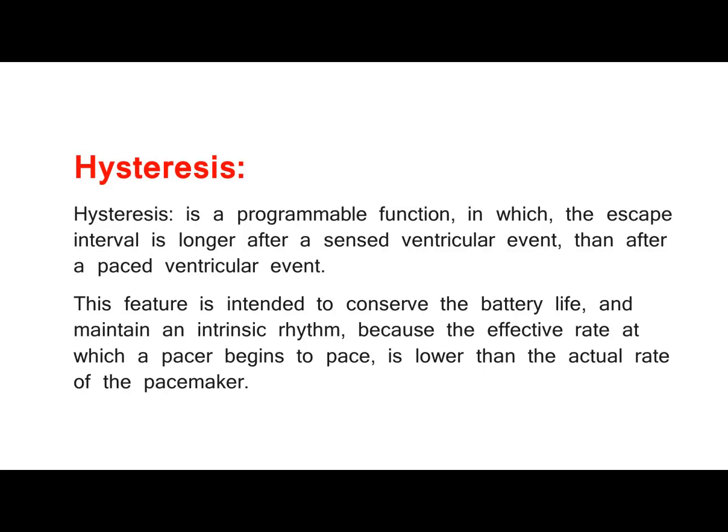Hysteresis. Hysteresis is a programmable function, in which the escape interval is longer after a sensed ventricular event than after a paced ventricular event.